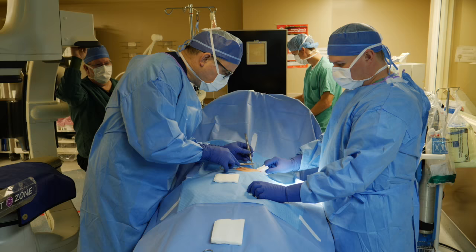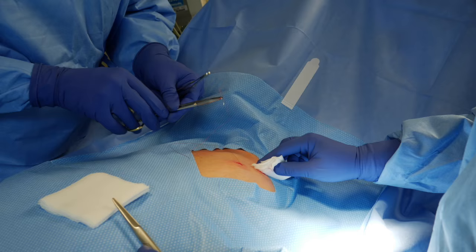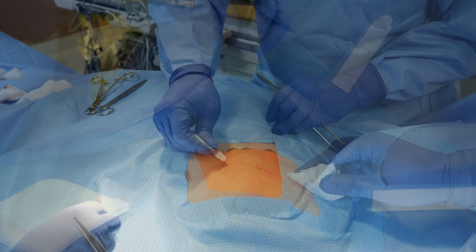We don't want any discomfort — we want minimal scarring. There we are with the implant team just finalizing those initial sutures. And then finally we'll seal that insertion site with surgical glue — surgical glue that fits about the size of a quarter over the device. It'll be acceptable to shower starting tonight. That glue will wear off in about a week, and we have every beat of the heart starting now.